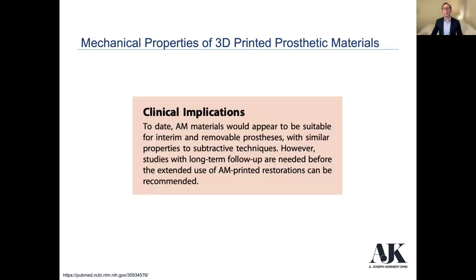And so the takeaway here, if there's one point to go home with or go to bed with tonight, are the clinical implications. To date, 3D printing materials appear to be suitable for interim and removable prostheses with similar properties to the milling techniques. However, studies with long-term follow-up are needed before the extended use of these printed restorations could be recommended.